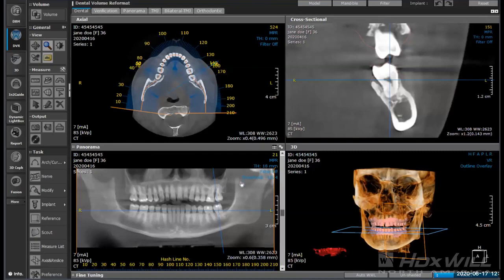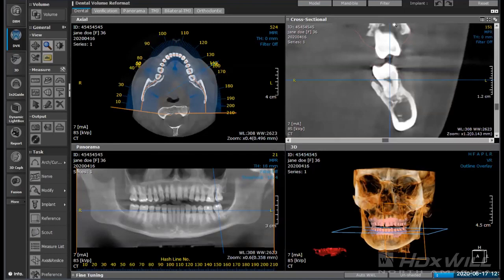So one last thing I wanted to present, let me see, I have something from a chat. So again, a perfect question was, if our office doesn't have an intraoral scanner, is there another way to create an STL file? With that in mind, yes, there is.